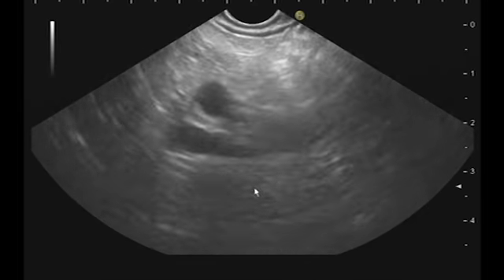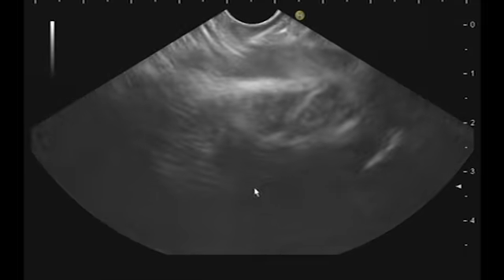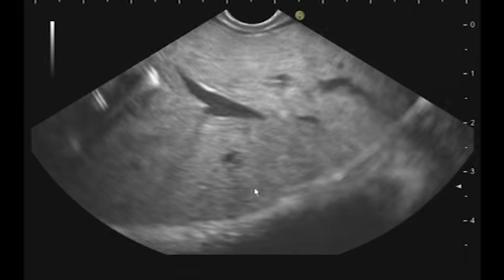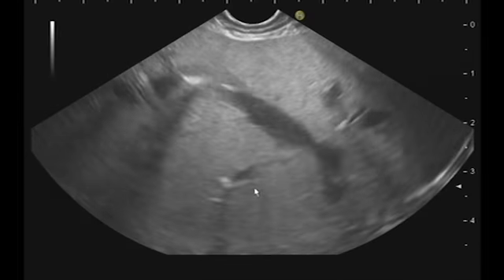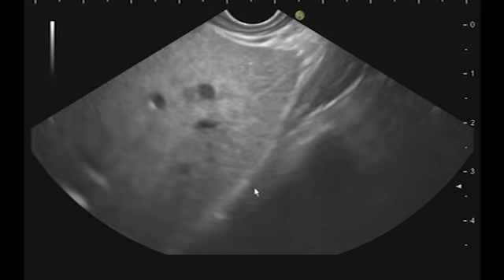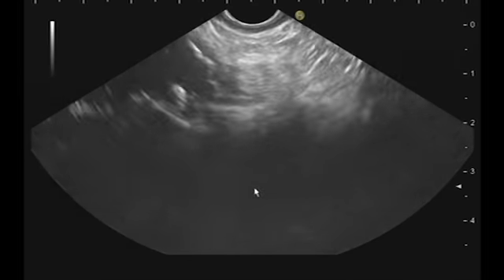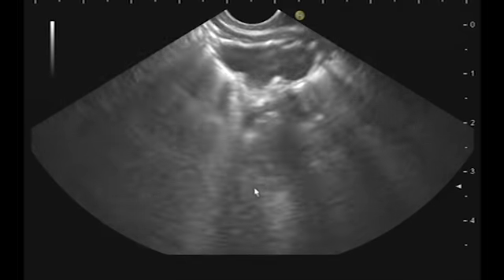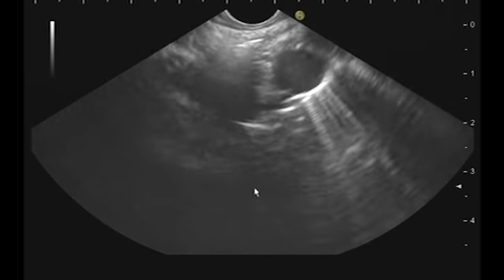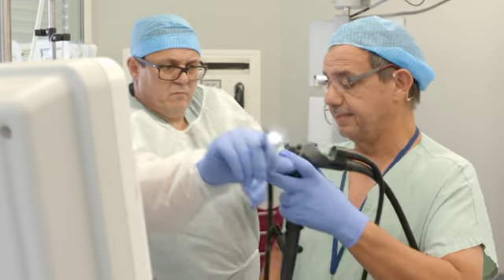And this is the tail of the pancreas. Okay, now I just check quickly the left lobe to be sure that there is no small metastasis. Here you see that there is a dilatation of the duct, but no metastasis. And there is no contraindication for surgery in this case. And I think now I will change my scope for the duodenoscope to change the stent and to perform a new series of biopsy, because there is no histology for this patient.